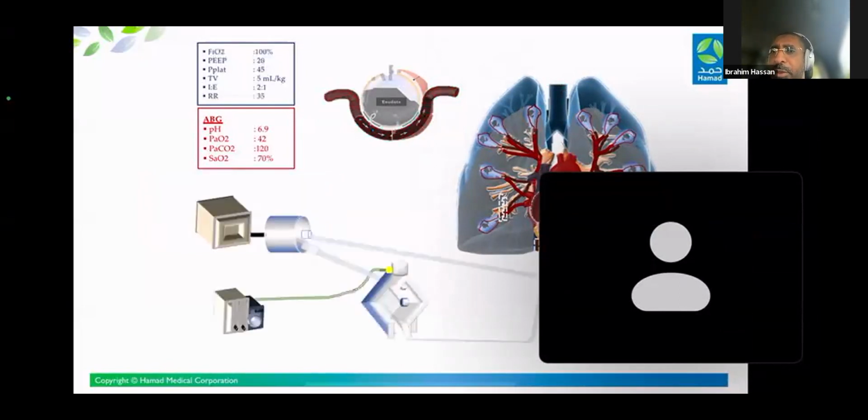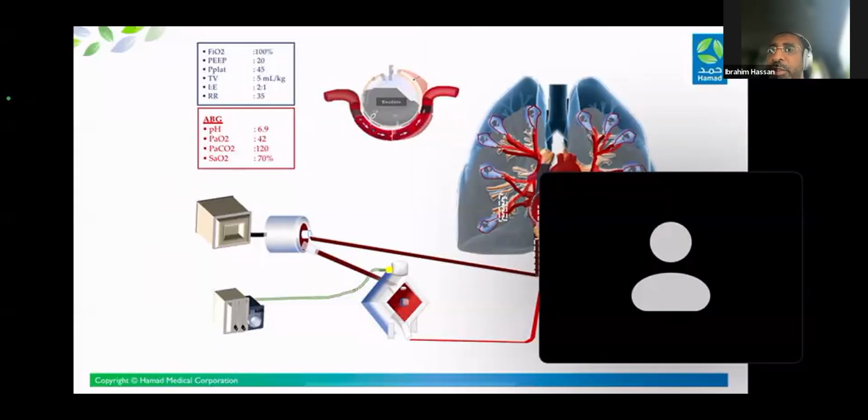When you add them and you cannulate an ECMO, it works this way: the blood comes through the pump by negative pressure, it goes with a positive pressure to the membrane, gets oxygenated, CO2 gets removed, it returns back to the right atrium, pulmonary artery, and you see it go through the capillary already, the shunt oxygenated already, blood that's bypassing already that shunt because it doesn't need ventilation, and the blood gas quickly usually gets improved most of the time. And then you don't need this injurious ventilation anymore. That gives you the support that you could not achieve otherwise.